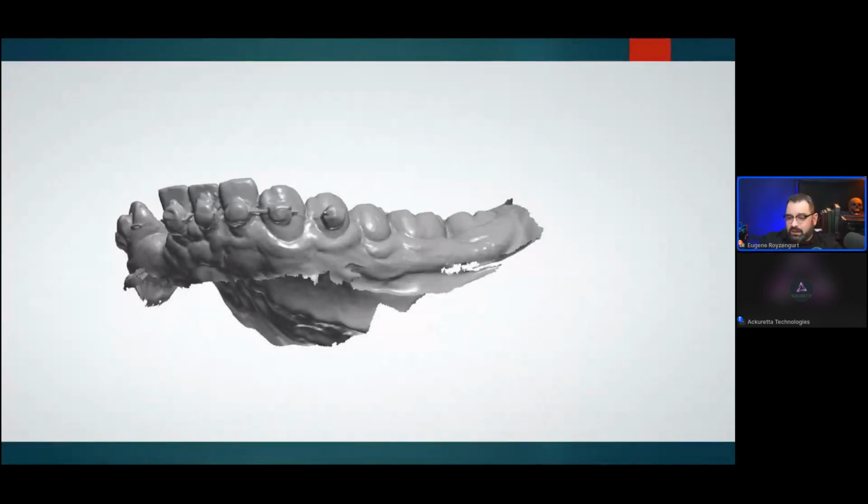So that might be something you need to look into, but I've never had to use one. What's the difference between the Soul and the Asiga printers? So Soul is an LCD printer versus Asiga is a DLP, which is, I think, digital light projection or something like that. So that's two different types of printers. Okay. Does Soul have an internal radiometer? I do not have an answer to that question. I'm sorry, Dan. Okay, let's move on, because we're already at 2:37. I barely touched on stuff.